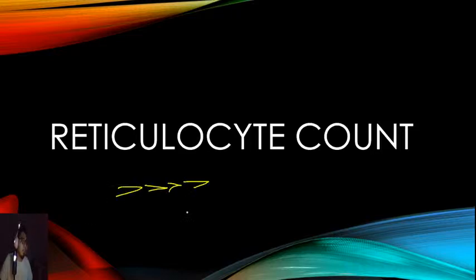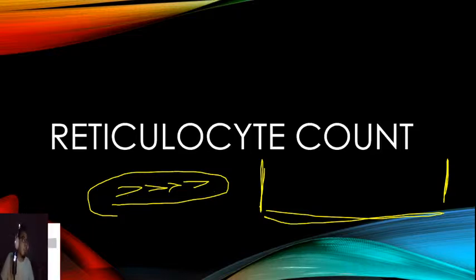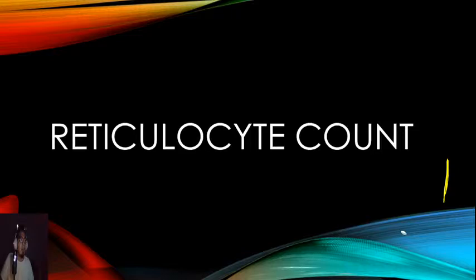What's that, sir? Greater than. Usually you would see that when the count is so high that it exceeds the machine's linearity. When I say linearity, this is the range at which the machine has the capacity to count the samples. All right? You're going to hear the word linearity several times when you discuss clinical chemistry, but there is linearity also in hematology. So when you see a lot of greater than samples, that's the time that you're going to do either a dilution of the sample or a corrected count of the reticulocyte counts.